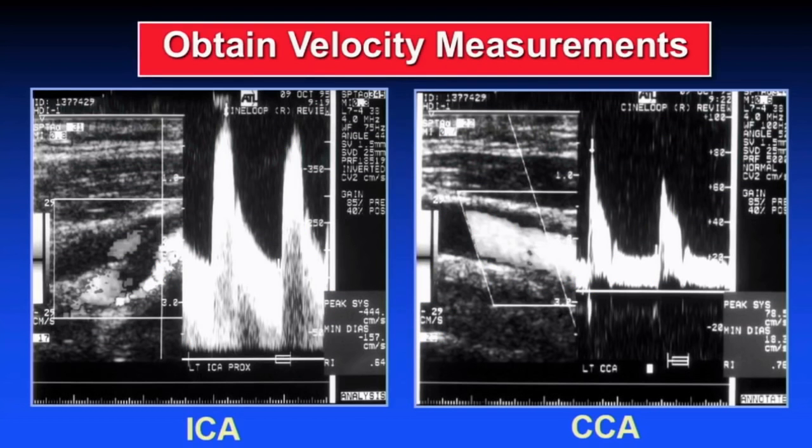So how do we do Doppler? Most of you are familiar with it for the carotid arteries. We're using velocities as a surrogate to identify flow-limiting stenosis, because as we know, as the vessels narrow, the velocities increase in order to keep a steady state of flow to the brain. So as the degree of narrowing increases, the velocities increase until a critical period of time, and we'll talk about that a little while later.